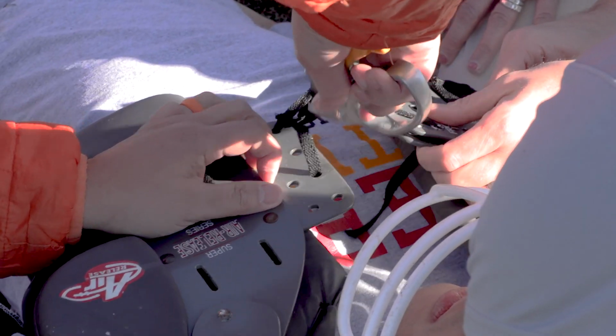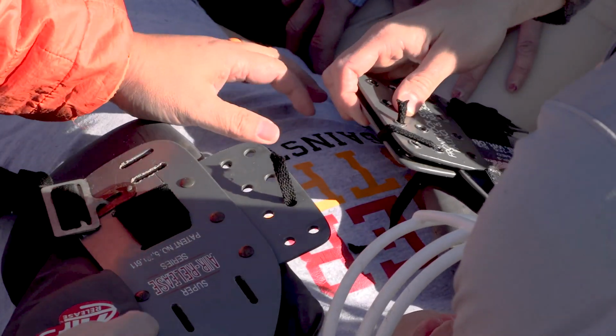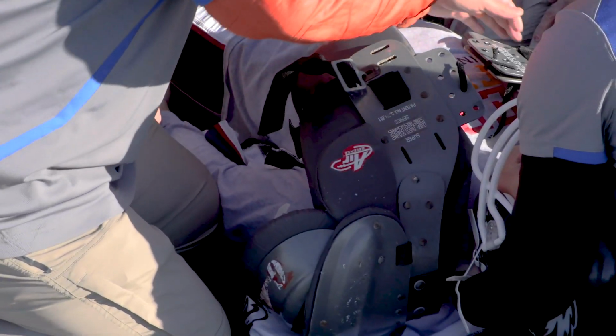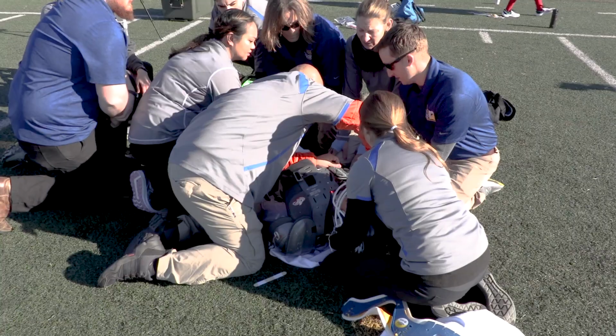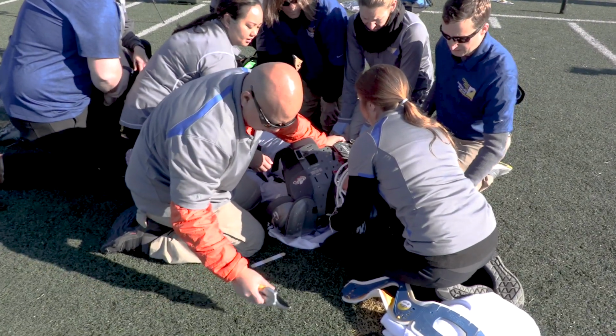Cut the shoulder pad ties in front. If the athlete has ripcord pads, the ripcord can be found and released. Cut or release the clips from the front panel of the shoulder pads and ensure the strap is cleared out from the athlete's axilla region in preparation for removing the shoulder pads.